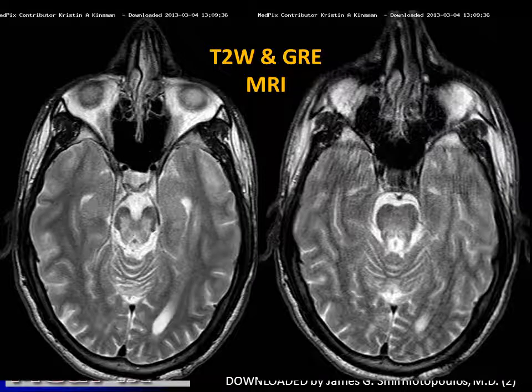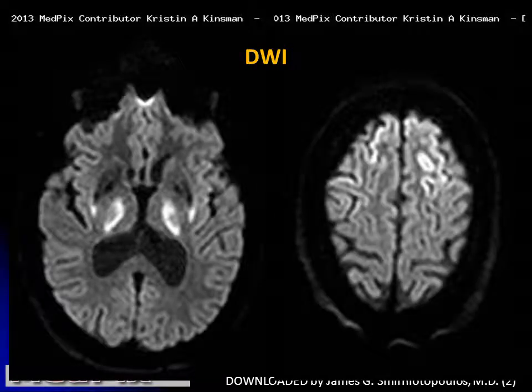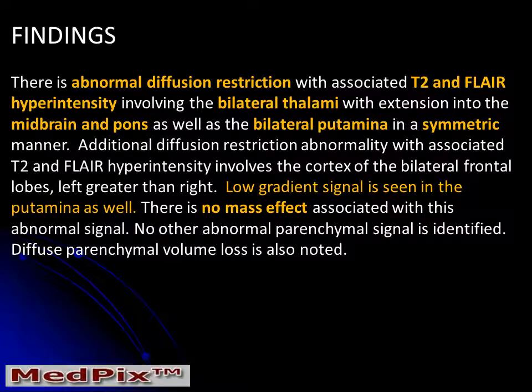He had these abnormal MR images on T2 and GRE. We can also see abnormalities involving the thalamus and the lateral portion of the lenticular nuclei, the putamen. He also had diffusion abnormalities involving the cortex and the thalamus bilaterally. In summary, this patient had abnormal diffusion and abnormal T2 and FLAIR hyperintensity patterns involving bilateral thalamus, the midbrain and pons, bilateral putamina, in a symmetric pattern with no mass effect whatsoever.